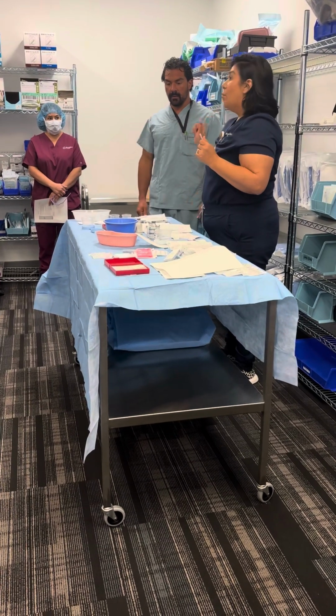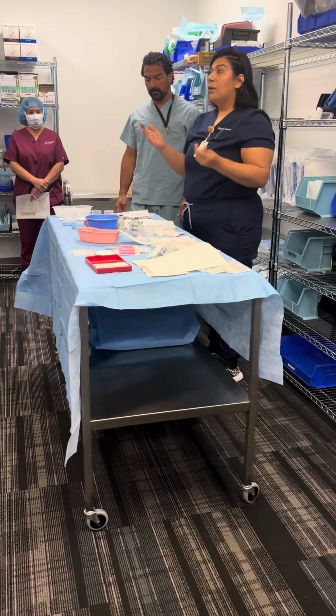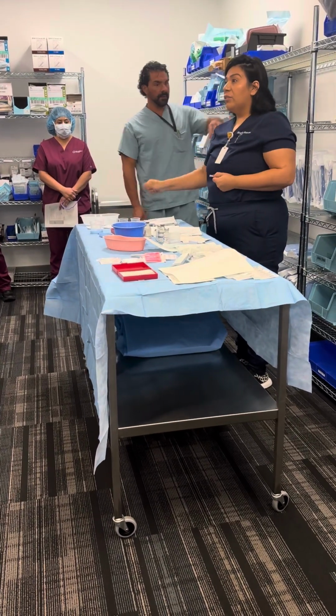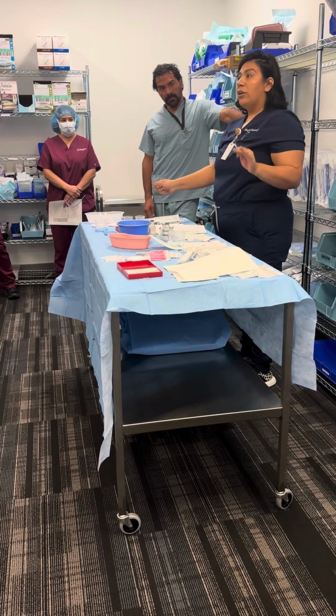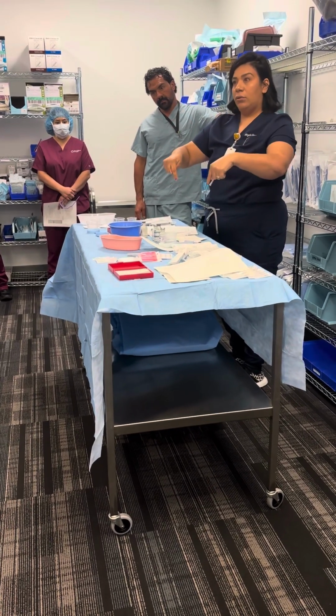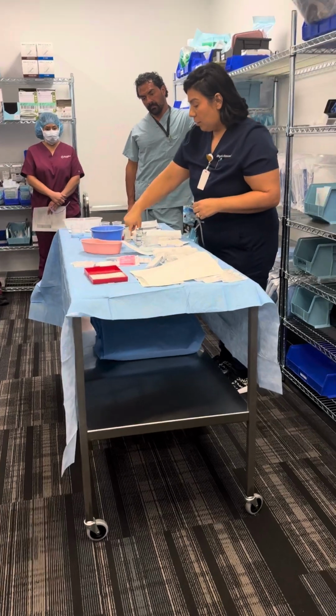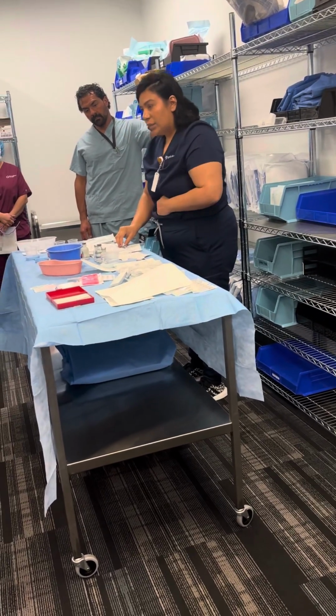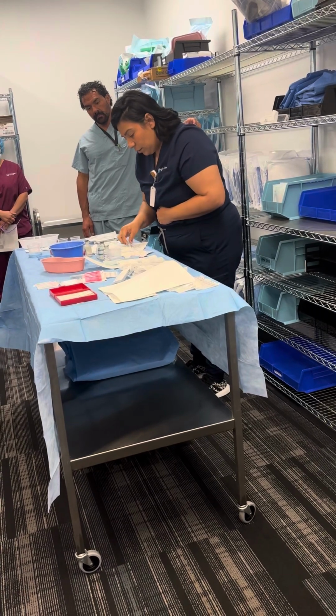When my surgeon has a sharp in their hand, my hands are here or on this side of my Mayo stand. I am nowhere near them because they're not focused on your safety, they're focused on the patient, okay? So I'm gonna take that back. I'm gonna recap it. See how I'm so used to doing this that it's automatic for me.